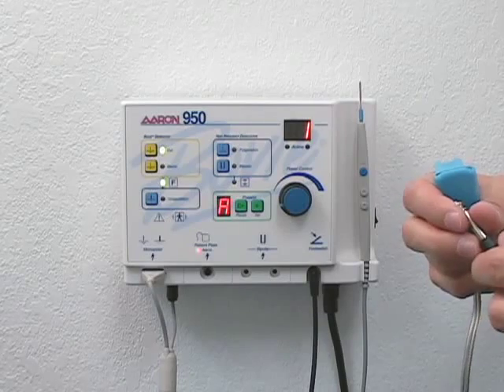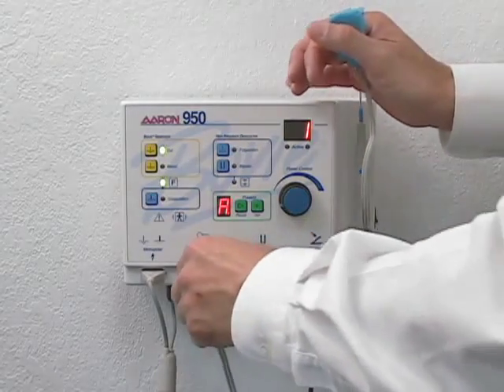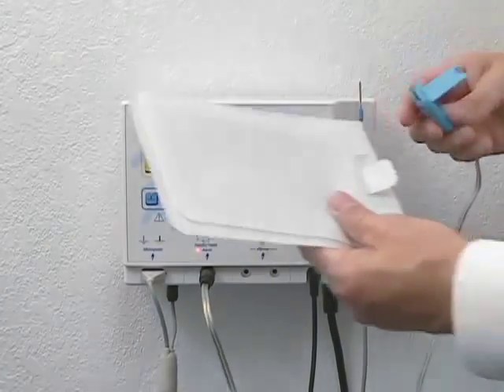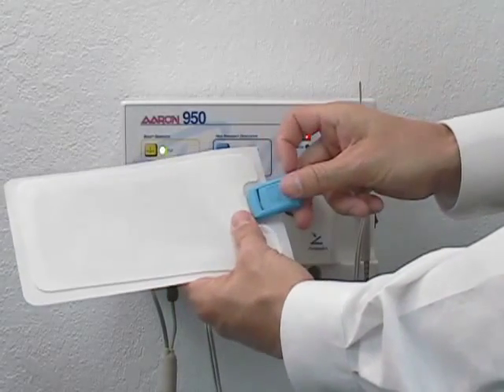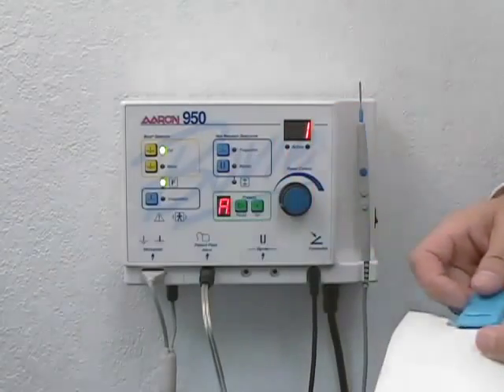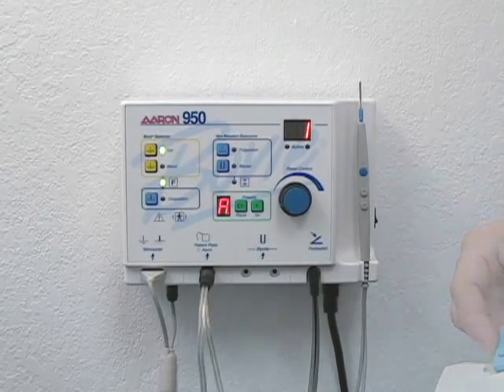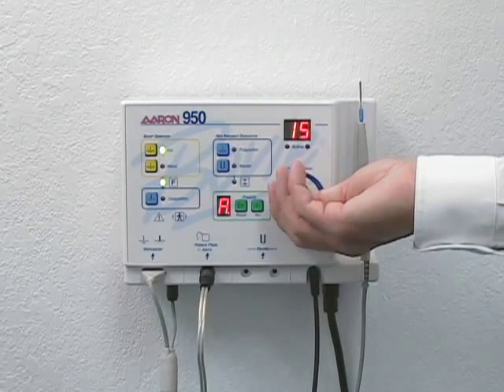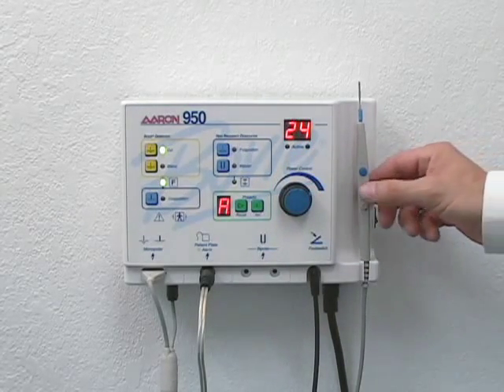To properly connect the grounding cable, plug the connector into the patient plate receptacle. To attach the pad to the cable, insert the tab into the clip, closing the locking mechanism. Notice that the patient plate alarm indicator is no longer illuminated. To adjust the power, simply rotate the power control knob to the desired setting, or use the up-down power control buttons on the autoclavable pencil.